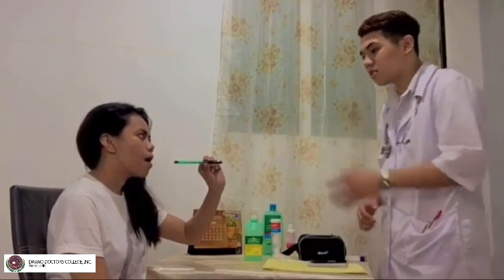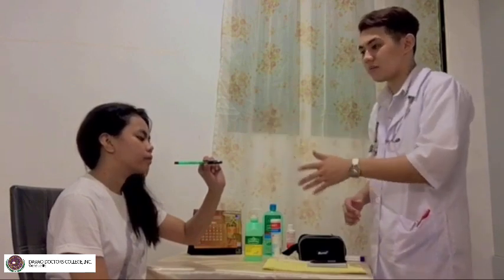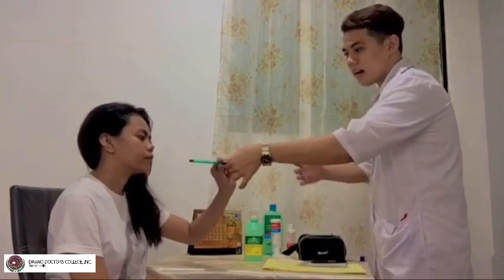Okay. So, wait for the appropriate amounts of time after the placement. So, electronic thermometers, just like this is just imaginary, will indicate that the reading is complete through a light or a tone. So, we just need to wait for any tone because this is a digital thermometer, ma'am, okay? So, if there will be a tone finally, we can just, can I have that one? Okay, thank you for that.